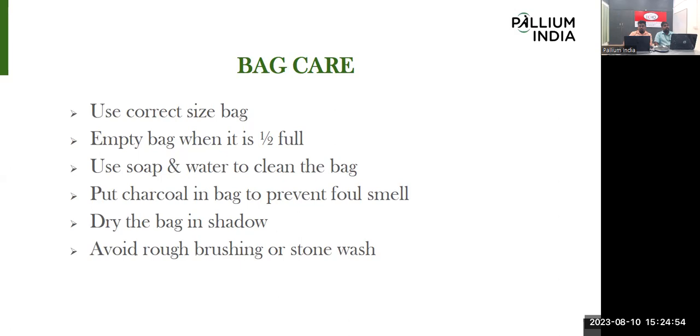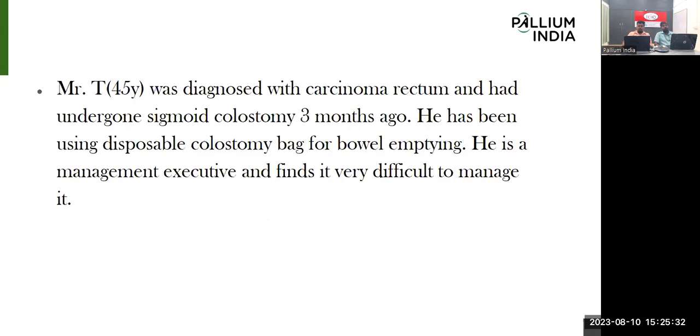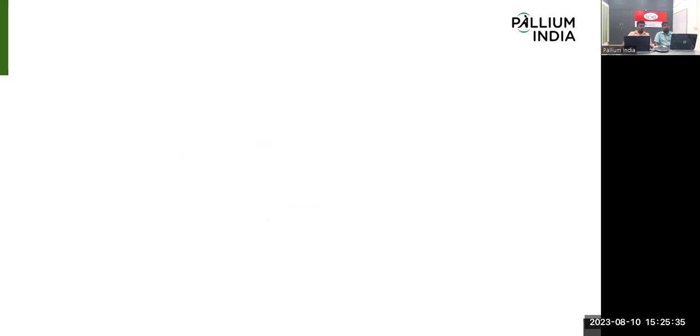While washing the bag, use soap and water. If the patient feels any foul smell, they can put small charcoal pieces inside the bag, which can prevent the foul smell. After washing with soap and water, dry the bag in the shade only. Don't dry it under direct sunlight because it will cause cracks on the bag material. They need to avoid stone washing and hard brushing on the bag.